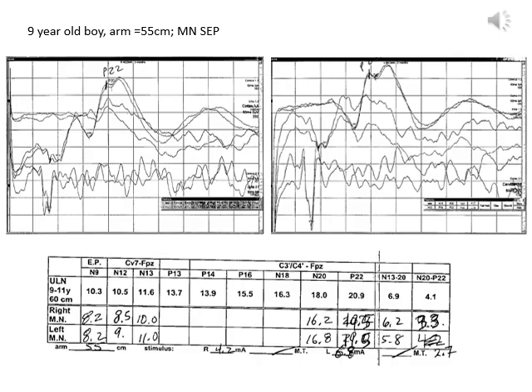This is a 9-year-old boy with an arm length of 55 centimeters. These are the upper limb median nerve recordings. And so first off, the recordings look fairly clean. They're reproducible. And starting at the bottom tracing, we see an N9, we see the little N12, N13 in the cervical recording. And then, although it overlaps a little bit, we see a very clear N20, P22.